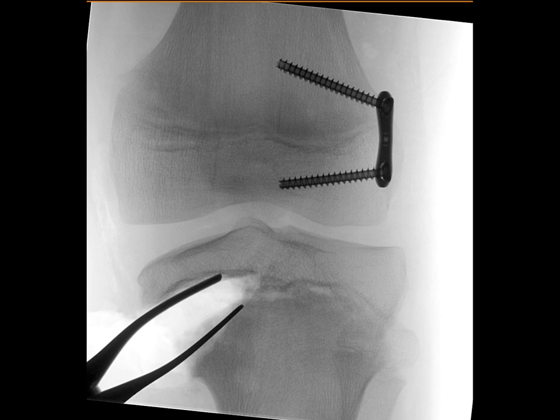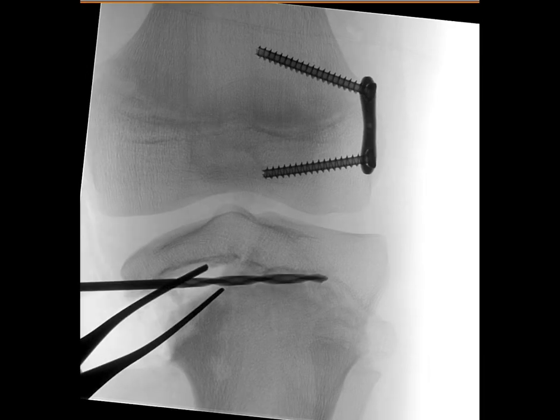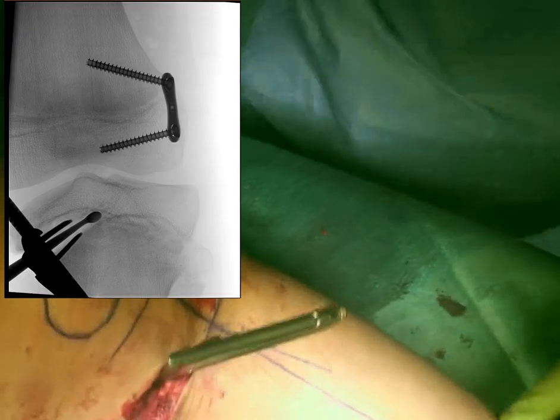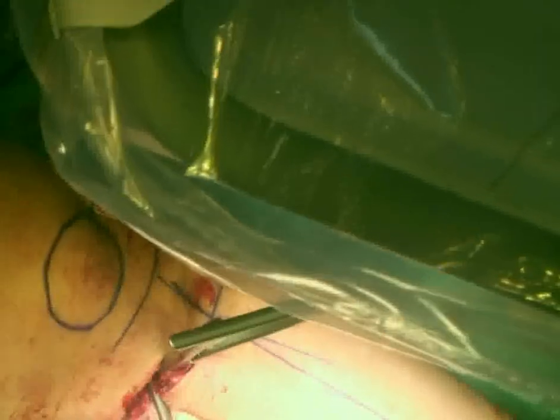Now I move to the second part of the procedure, which is completing the epiphysiodesis. This can be achieved by drill epiphysiodesis, in which we pass through the growth plate multiple times using a large drill, and whatever is left from the growth plate can be removed with the curette. This is a pretty effective way, however it is permanent.